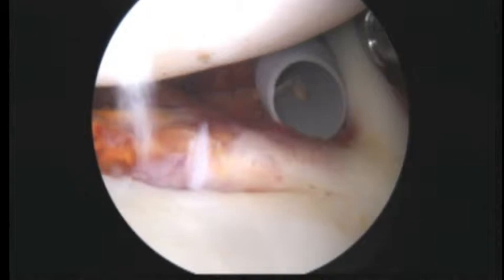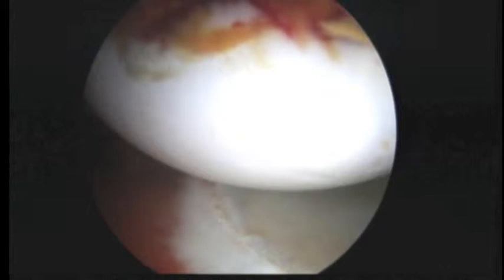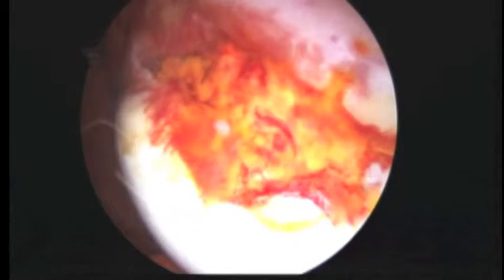Here's the posterior labrum, posterior capsule, posterior humeral head. It's only been about three weeks since your dislocation, and as we pull back we can get a sense of how this Hill-Sachs is situated in the humeral head right there. We classify that as a medium-sized Hill-Sachs — it's not very deep, but we can certainly see where the discoloration is in the humeral head.